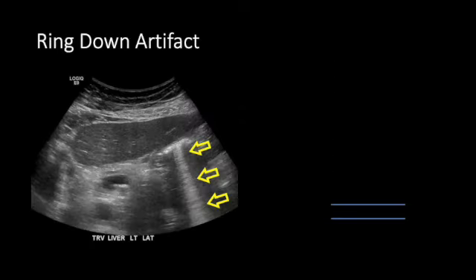The next artifact is called ring down artifact. And ring down is really just a reverberation artifact, but with a particularly special way of generating itself. So let's show you how this happens. So this is the right upper quadrant. We see the liver, we see a little portion of maybe the gallbladder or kidney. It's hard to tell right there. But then the artifact is this sort of flashlight looking beam that's coming down here on the right side of the image. Now, how do we get this?